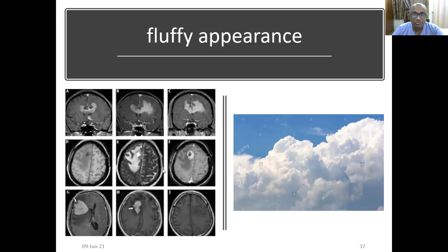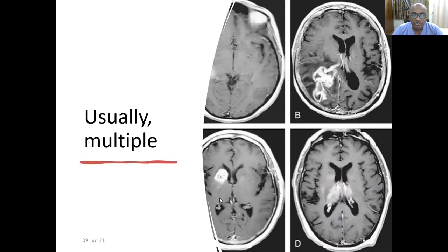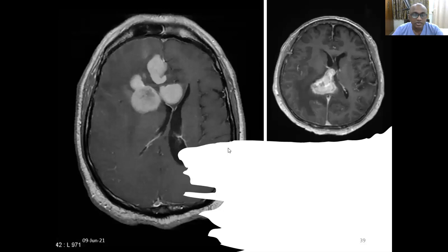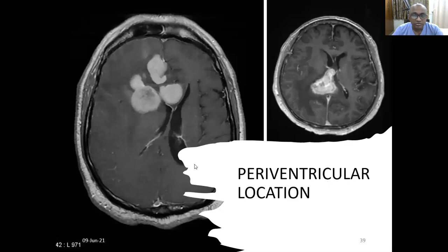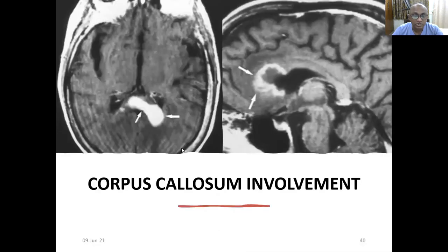The corpus callosum involvement looks like a cotton ball or fluffy appearance. This fluffy appearance can be single but also multiple lesions here and there. The lesion is mostly in the periventricular location, which is quite a differentiating feature from other brain problems.